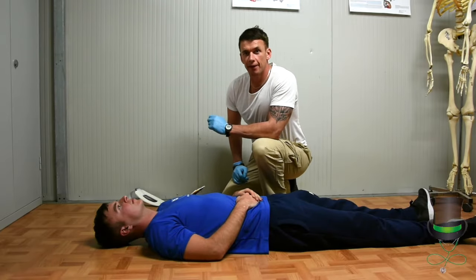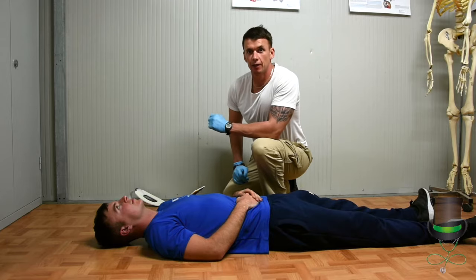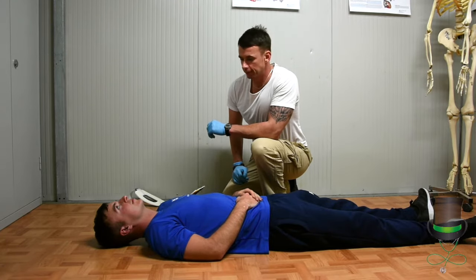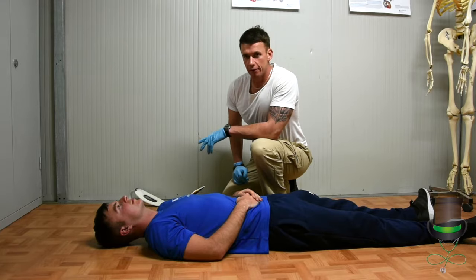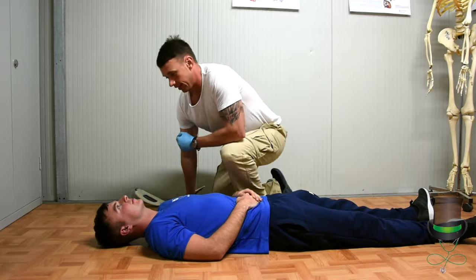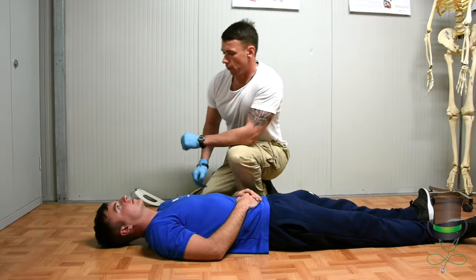Hi, my name is Anthony and I'm a paramedic. Today I'm going to demonstrate how to extract a patient on a spinal board. We'll take it that the primary survey is done and you've made your decision to take this patient out on a board.